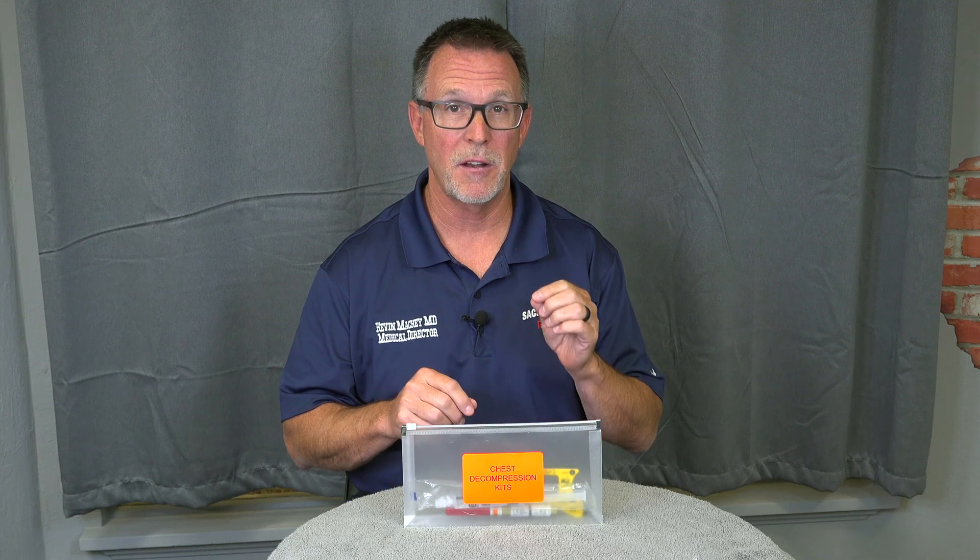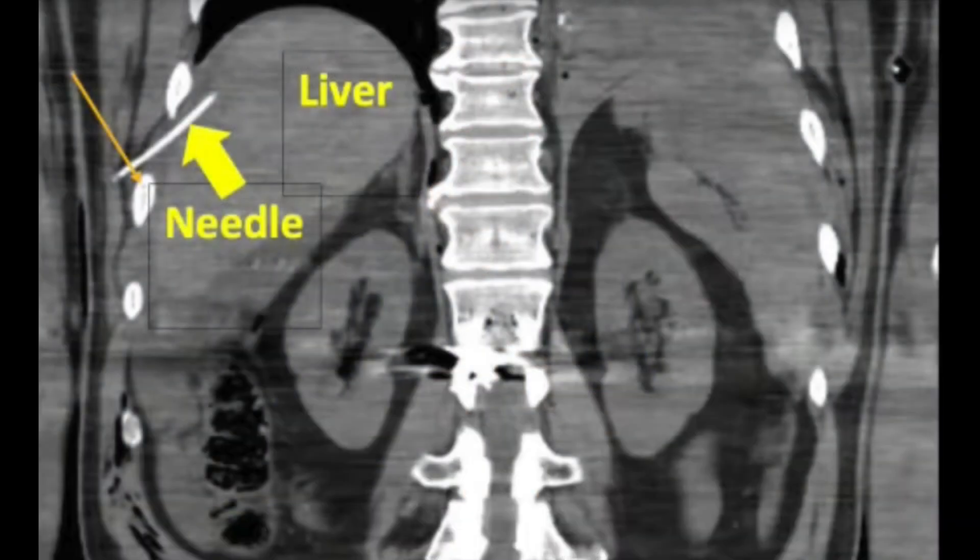Chest decompressions have to be done in the right spot every time without failure. A couple of big failure points: not getting in the right spot — going too low, like getting into the abdominal cavity — and also not actually entering the thoracic cavity to accomplish what's being attempted.